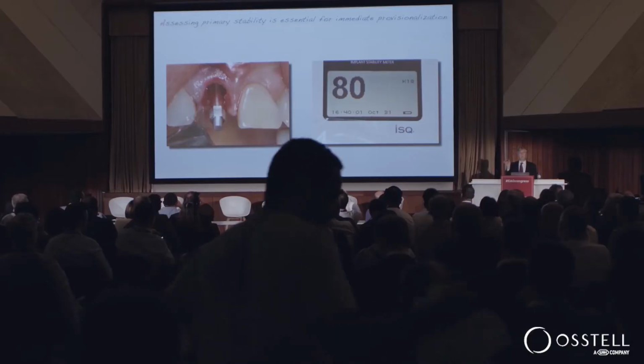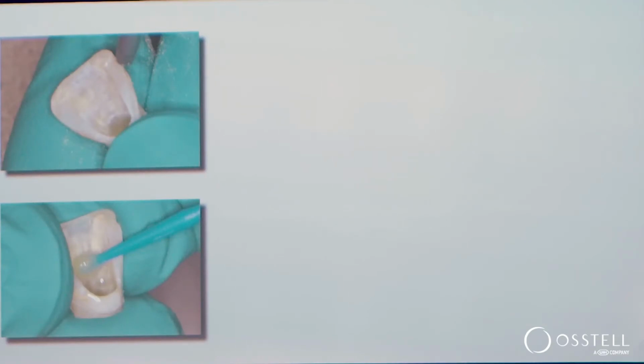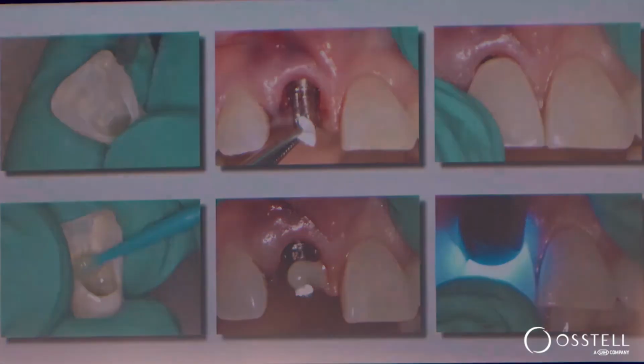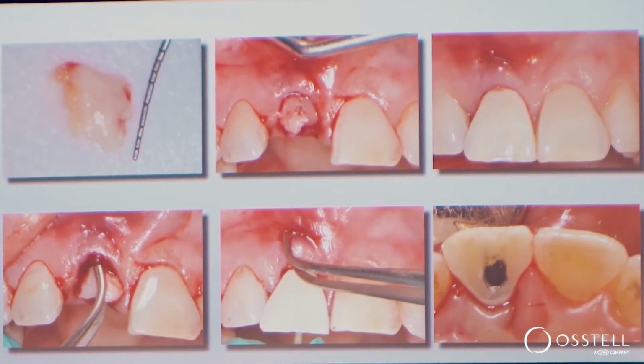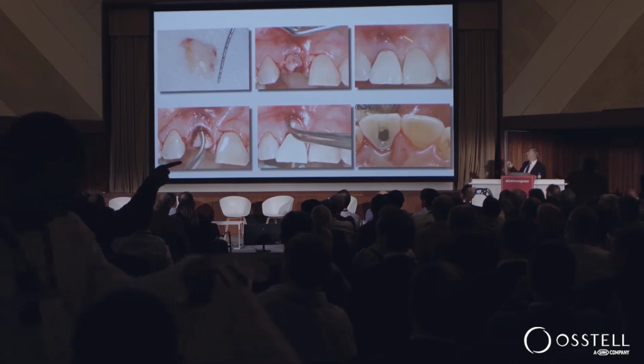So with that, we're either going to fabricate a provisional restoration, or we're going to make a custom healing abutment. And you can think of this provisional as being a long or an aesthetic healing abutment. In her case, we were able to take her natural tooth, hollow it out, convert it to a provisional restoration. One of the other keys is augmenting both the soft tissue and the hard tissue. In this case, it was done with a palatal connective tissue graft. And you can see how she leaves the office looking like this.